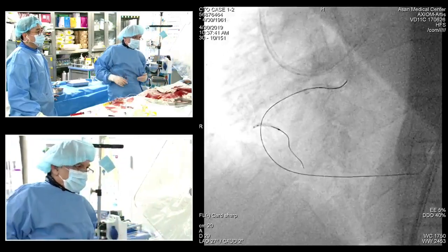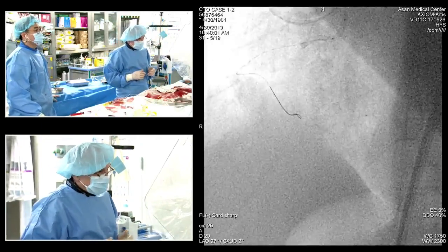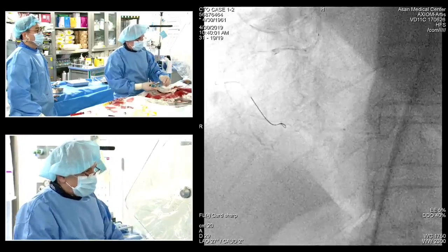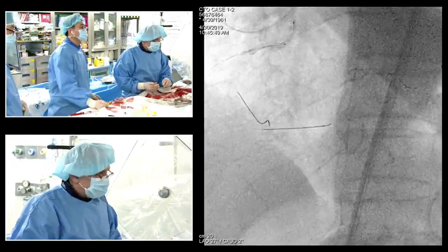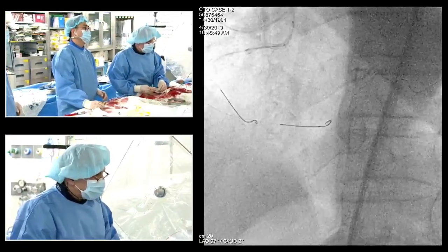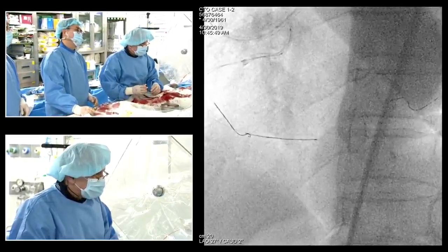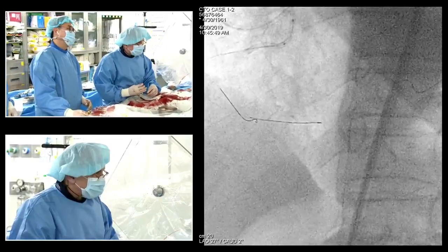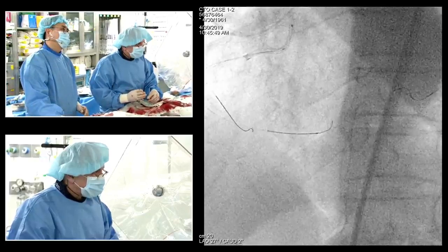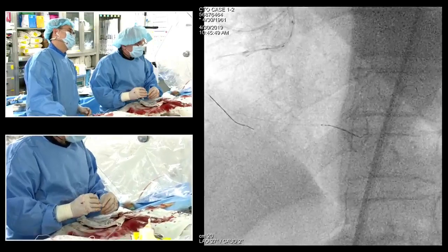And to make things a little bit short, so we put a trapping balloon, an anchor balloon, into the RV branch and dilated with a 2-0 balloon. And I confirmed the position, and right now we are in this situation that I try to get access to the bigger branch, distal, to kind of start the dilatation process. This is one branch. Actually, I want to go to the upper one. It's always, but I'm content maybe with this one.